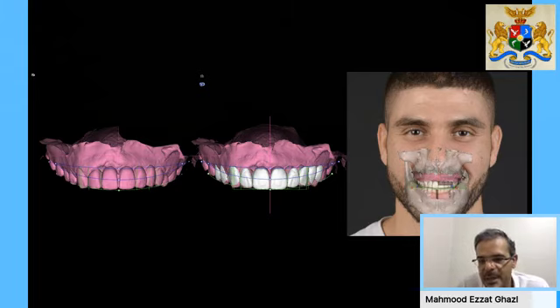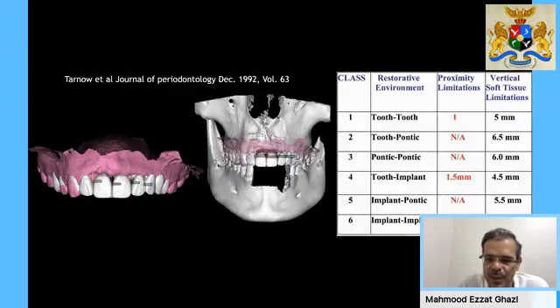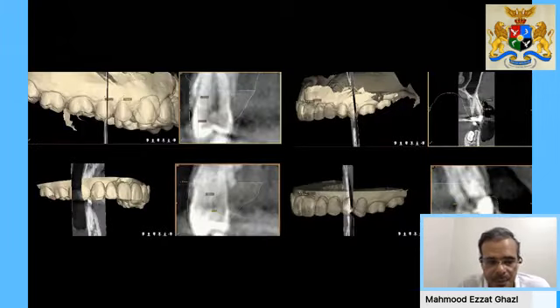And of course, we bring in the CBCT, the intraoral scan, and the patient's face so that we have the virtual patient once more. Again, referring to the studies, you can see that the deficiencies that we have are humongous. We have about 9 to 10 millimeters of deficiencies, an average of 7 to 9 between all the teeth. Of course, regenerating this prosthetically would be quite impossible. And we got these measurements from the CBCT. You can see the bone architecture here, how it's flat, and we have no interseptal bone between the teeth, of course, due to deficiencies that he already has or the bone that he has lost.